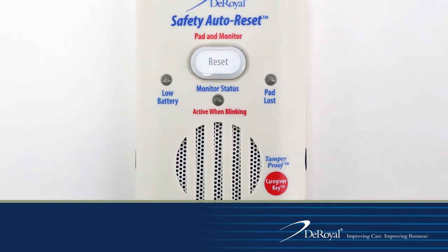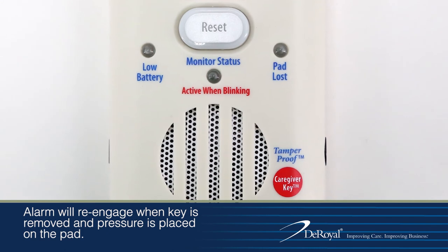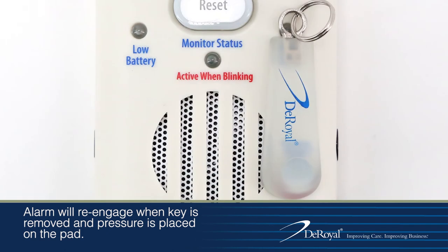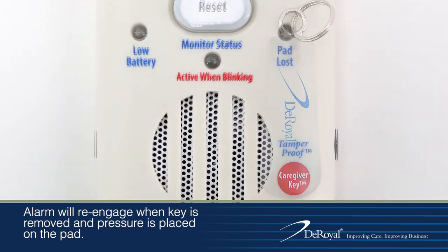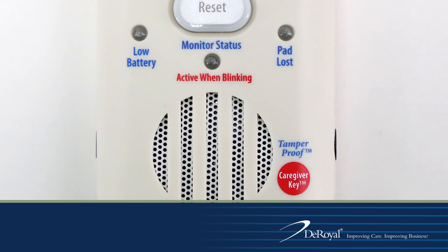The caregiver key can be used to temporarily disengage the alarm when needing to get the patient out of bed or chair without the monitor alarming. Simply place the caregiver key magnet in the red circle labeled 'caregiver key' on the front of the alarm. The alarm is now temporarily disengaged. To re-engage the alarm, remove the caregiver key. The alarm will re-engage when pressure is placed on the pad.